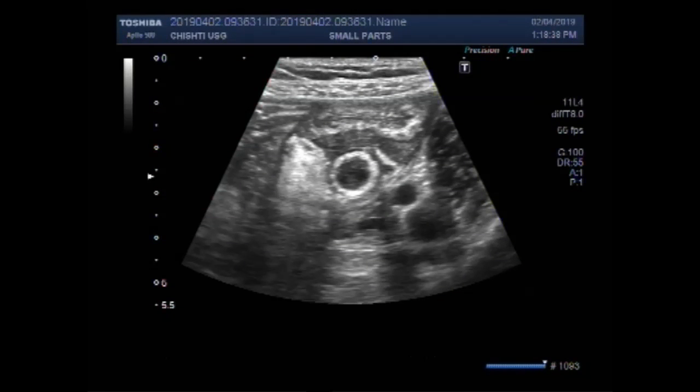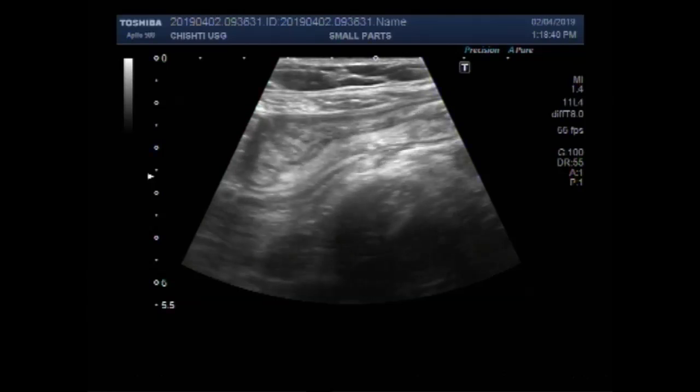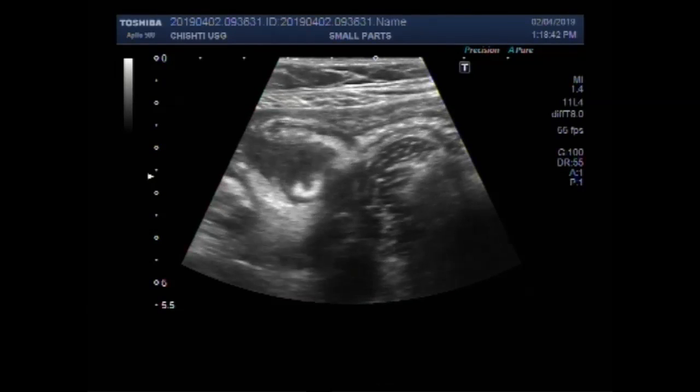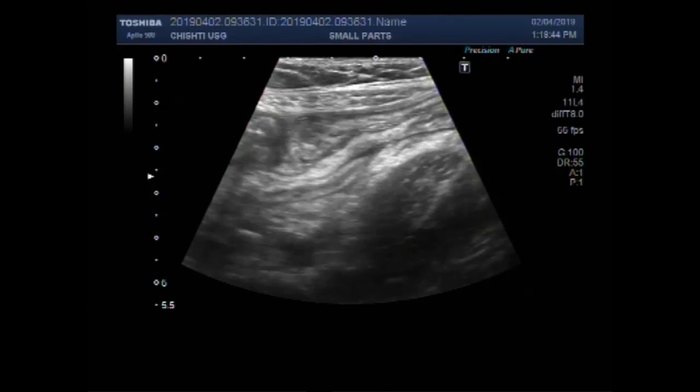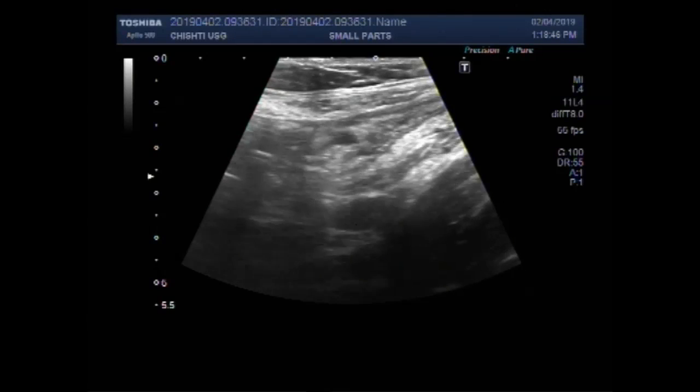Dear viewers, I hope you are fine. This ultrasound video shows focusing of the acute appendicitis.